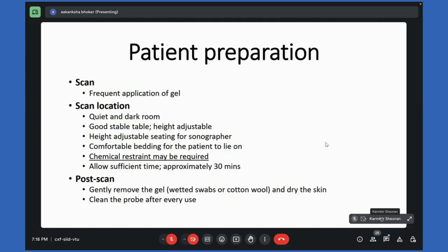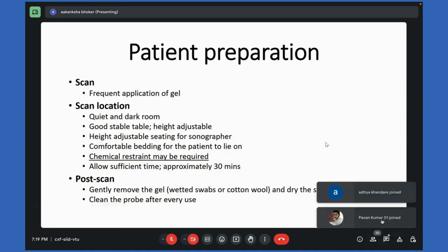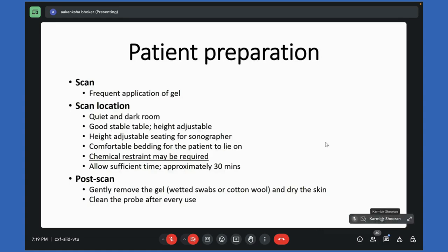Generally, the scan should preferably be performed in an area which is very dark and quiet. Dark so that our eyes can get accustomed to various shades of gray and we can resolve the image better. And it should be quiet so that the animal does not get disturbed while performing the sonographic examination. We should have a stable table which is not moving, which is height adjustable so that we can adjust it as per the size of the animal which we are dealing with. Also, the seating for the sonographer should be comfortable. It should also be height adjustable.